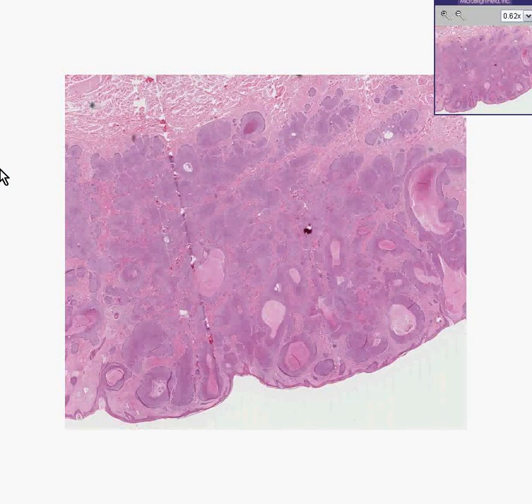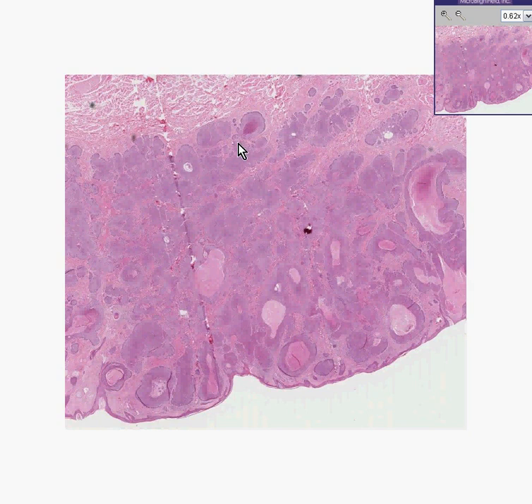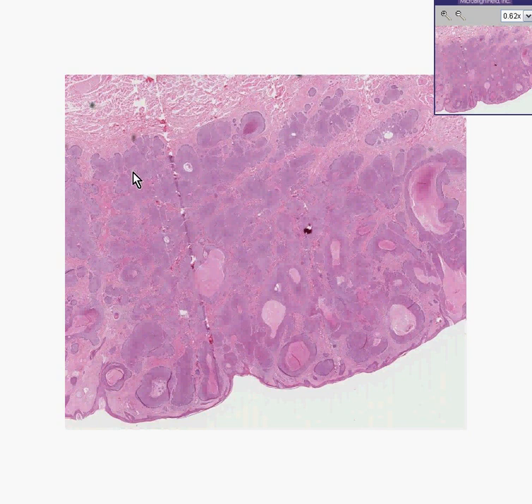Here is another skin tumor. You can see that all these little nests look like tumor nests, and they appear to invade into the deeper parts of the dermis.